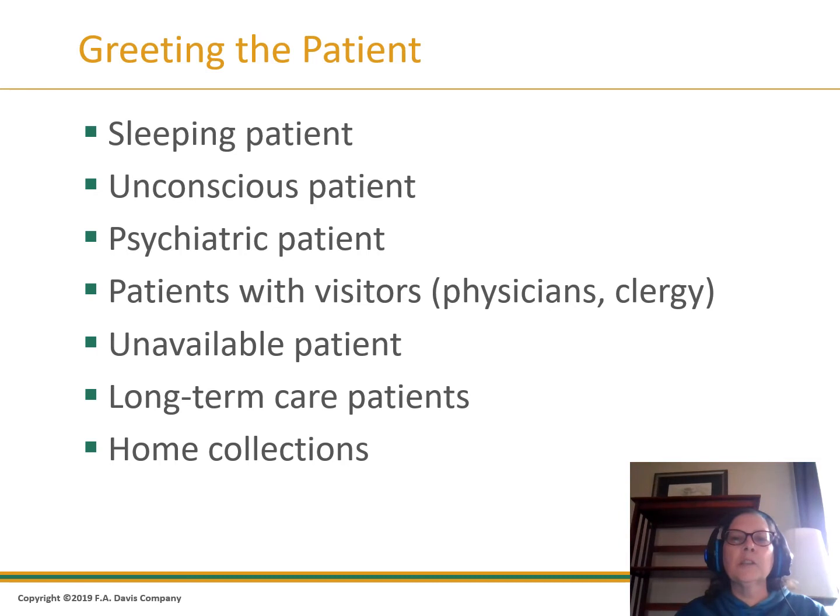Then you should explain to the visitor that you need to collect the blood. If visitors are present, you should greet them and give them the opportunity to leave. If a patient is not available, you should contact nursing staff to locate them. In long-term care facilities, be sure to check for restrictions. If you collect samples at a home, these should be scheduled, pets should be put away, and you should not enter without permission.